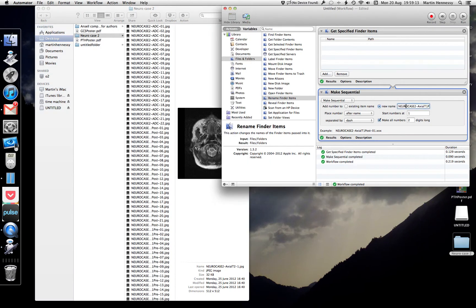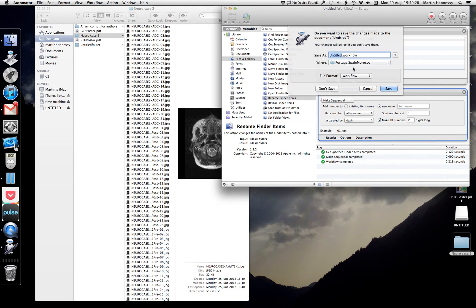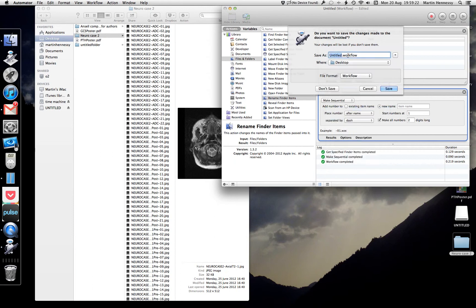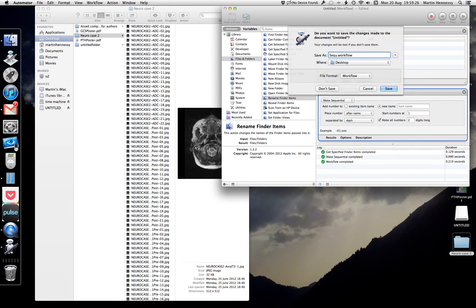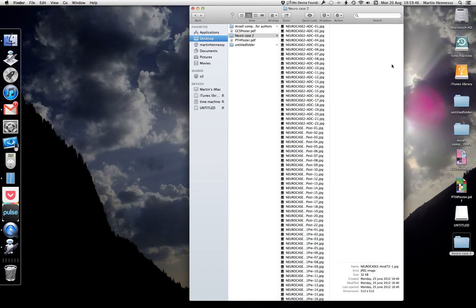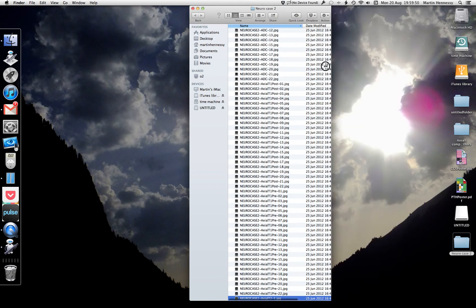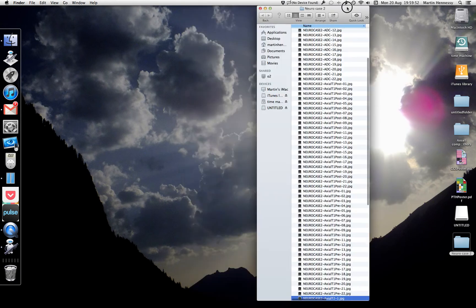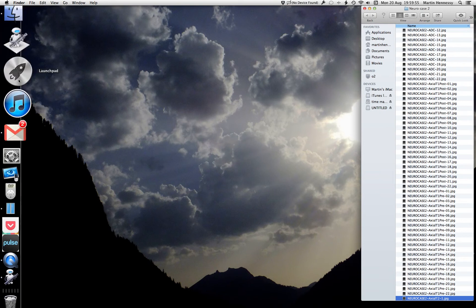We can now close Automator. It will give you the option to save the workflow — you may want to save it as 'Sequential Rename', and then next time you double-click that workflow it will open up already configured like this. It's very useful for this kind of task and also for renumbering photos. I've already got a copy so I don't need to save it. Now I have my case ready, so let's launch OsiriX.